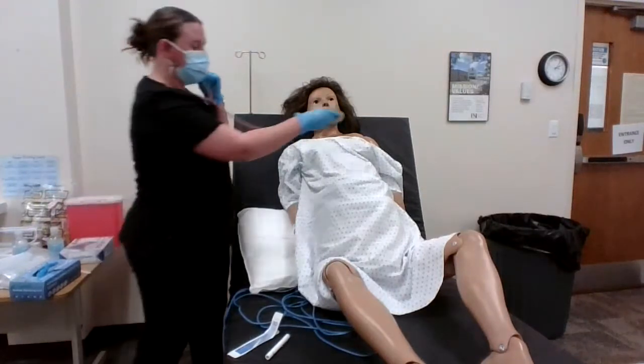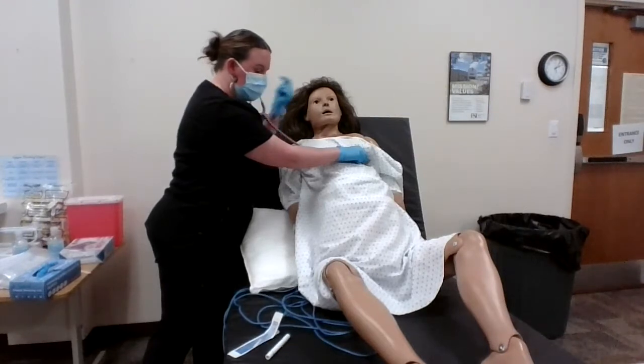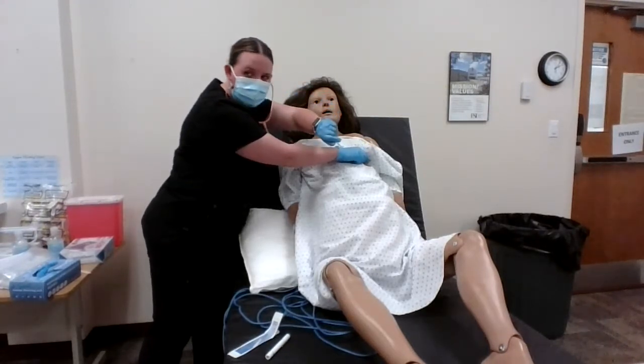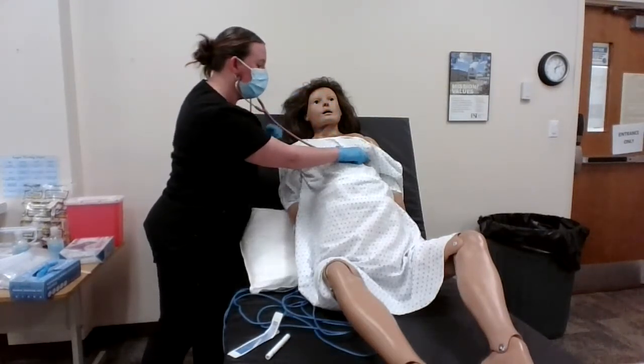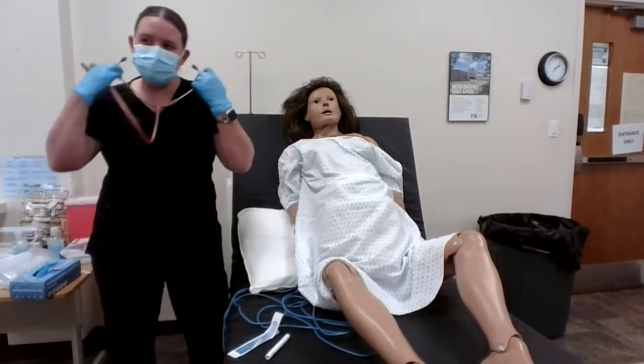Auscultate the apical heart rate for 1 minute with your instructor. Measure and document the rate and the rhythm. You must be within 4 beats. So you're gonna listen for a whole minute. Make sure you have a watch with a second hand so you can count, or you have a clock nearby. I got 64 regular strong.